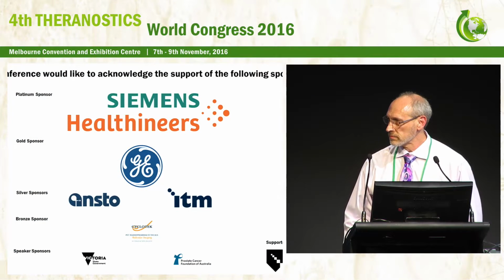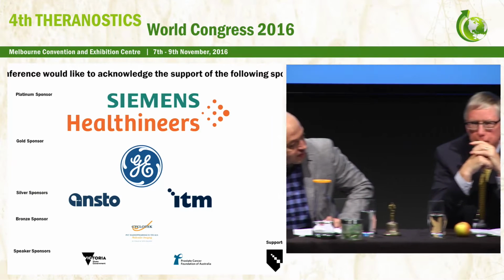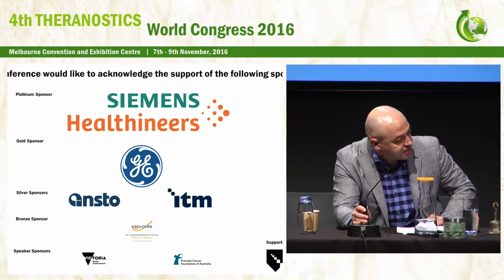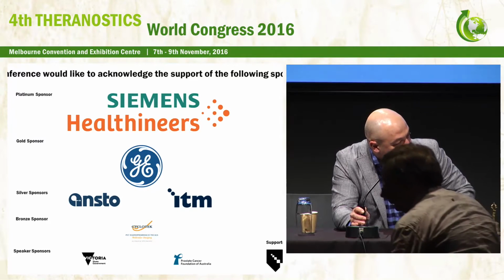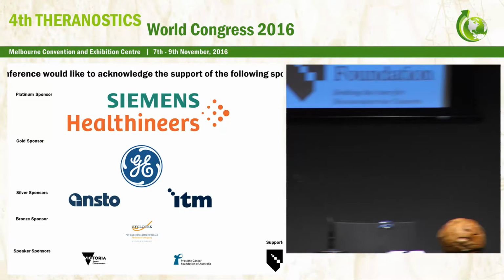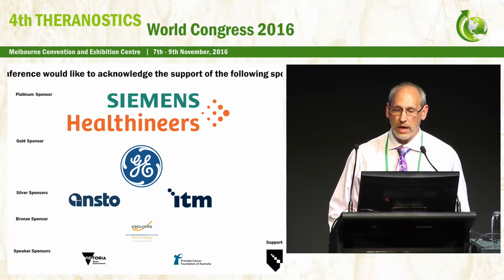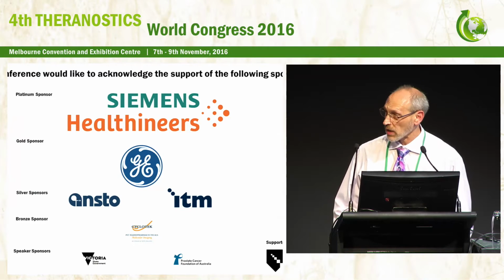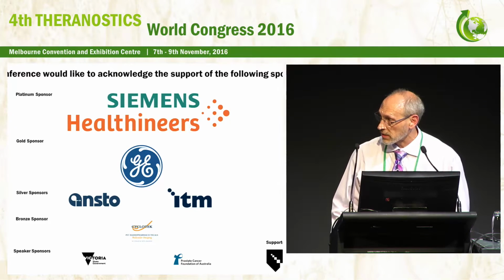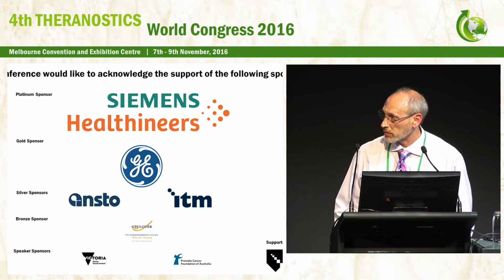While people go out, maybe we'll start with, can you detail a little bit what is the procedure for PET? How long does it take to acquire the PET images, and are these done with time of flight? Yeah. So this was done on a Siemens MCT. It was done with time of flight. We did not use the resolution recovery on this particular data set. We acquired in a single bed position for 30 minutes.